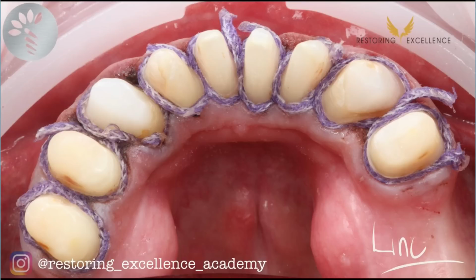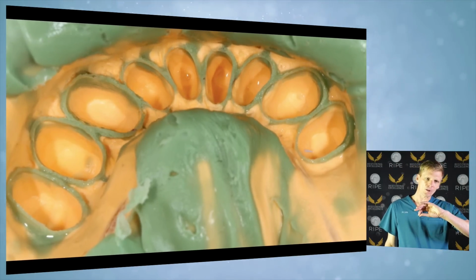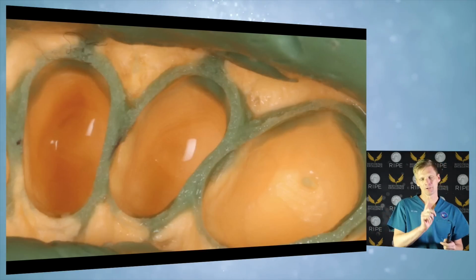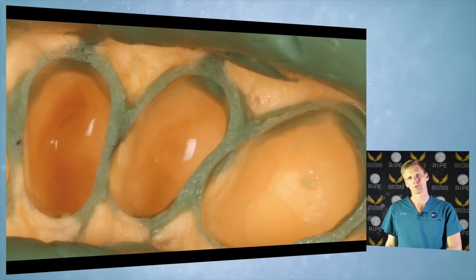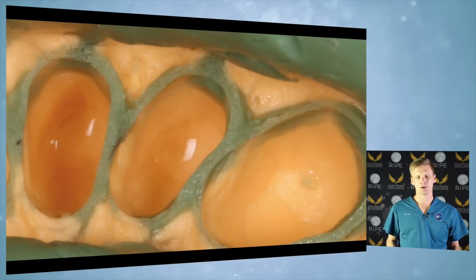And this impression, I got first go, so all 9 teeth. Obviously it gets harder if you start adding the posterior teeth as well, but it's the same process, and you just go through it. Now, I will tell you that in that case there's probably 35 minutes just spent packing cord. But it takes a long time to retake impressions, and often you end up with an impression that's bad, so why not just take the time?